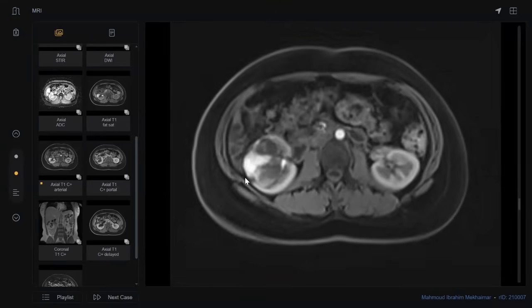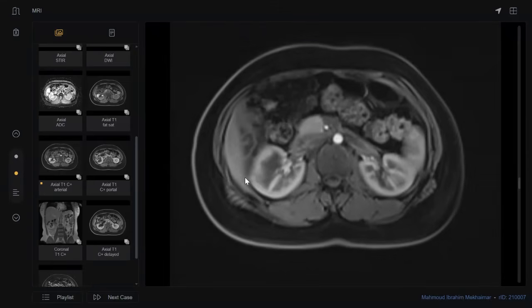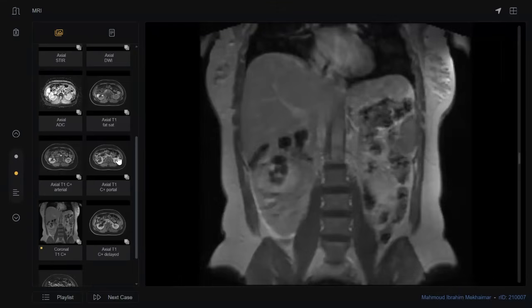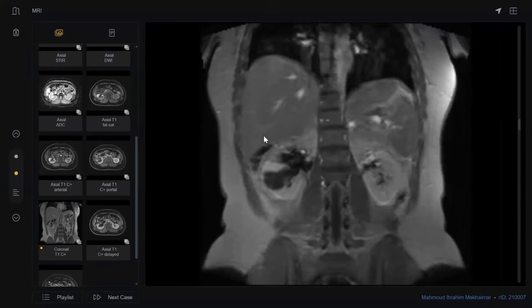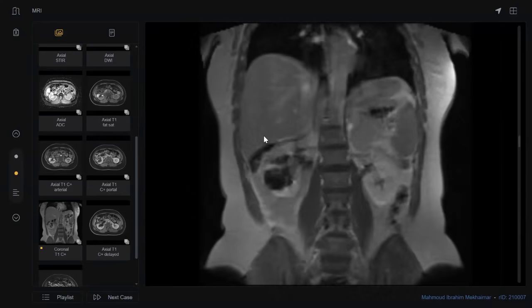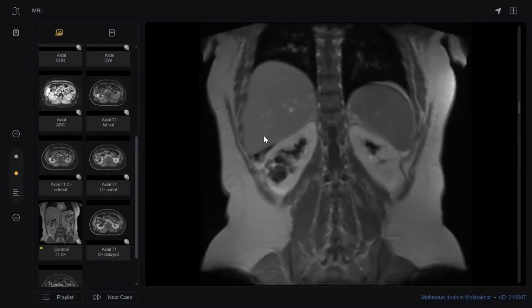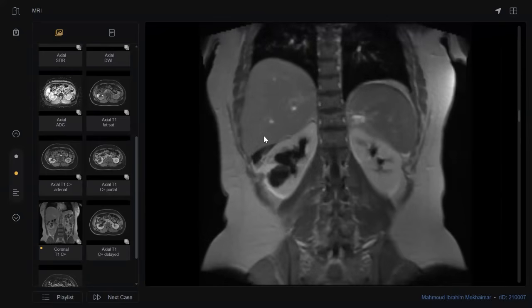What should you do if you are still confused between T1 pre- and T1 post-contrast when looking at enhancing tissue? Subtraction. If I'm confused, I ask for subtraction. Okay, subtraction. Thank you so much. Thank you, sir.